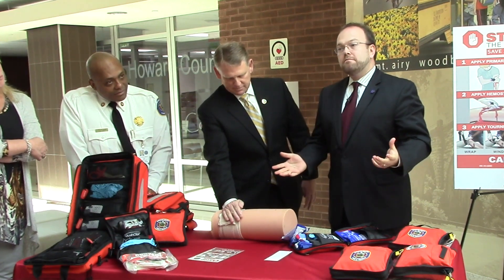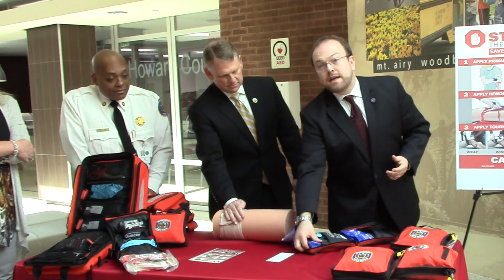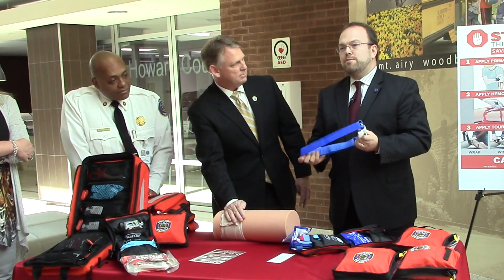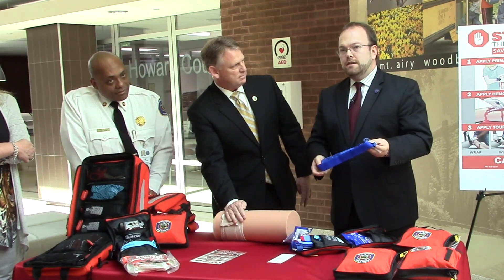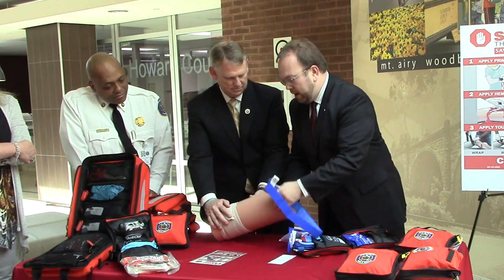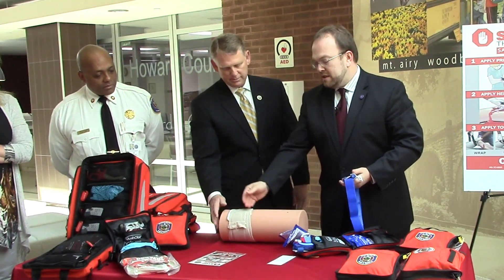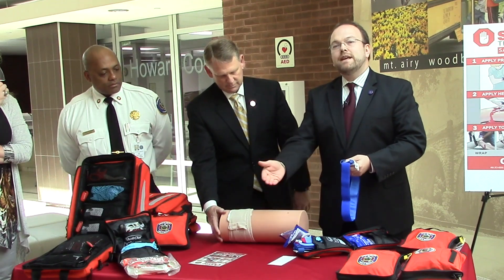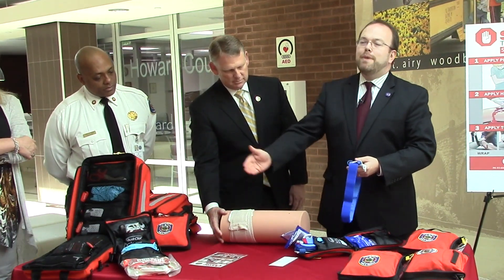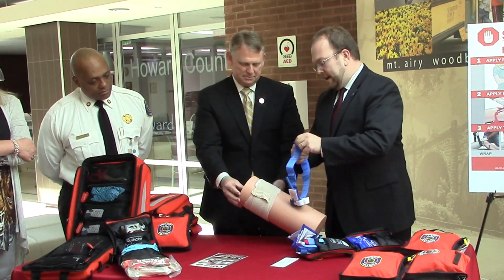By now you get the theme: press and hold, press and hold, pack and hold, press and hold. But sometimes that's not enough — sometimes, despite that, you need to do something else. That's where tourniquets come into play. Tourniquets serve a role in that they will actually provide circumferential compression of the bleeding vessel. For the purposes of demonstration, we're going to pretend that the area closer to the patient's heart is here, so we're going to go above the level of the injury.